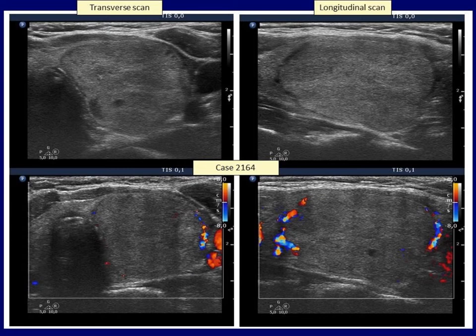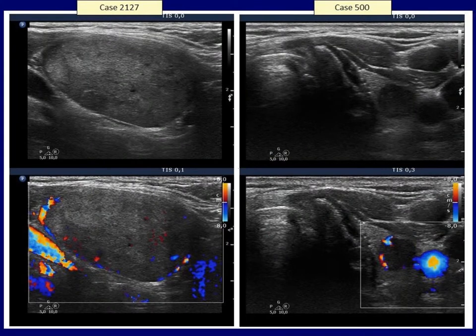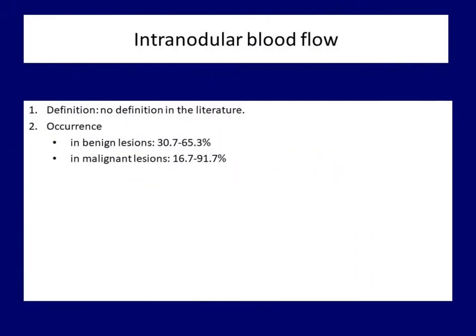These cases also present both perinodular flow and halo sign. In a follicular cancer case, the presence of halo is obvious while the perinodular flow is observed in less than 25%; in such cases I use the phrase 'signs of perinodular blood flow' in my reports. The presence of perinodular flow cannot be debated in the left nodule. In the right case, vascularization is seen at the periphery of the nodule, but the vessels seem to be located within the nodule and the vessel marked in green does not follow the arc of the surface marked with yellow arrows, making the pattern equivocal.